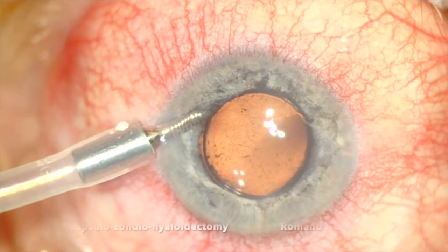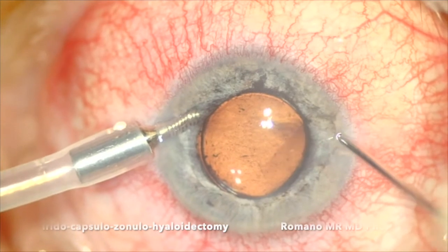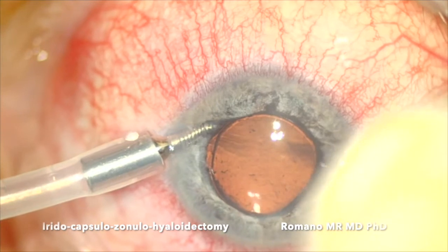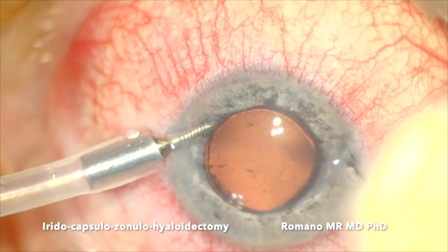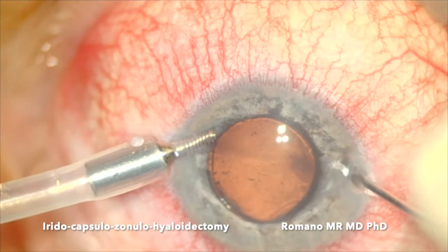In this case a 25-gauge probe cutter, going to the anterior chamber straight down to the peripheral iris — so peripheral iridectomy, capsulotomy, zonulectomy, hyaloidectomy, and anterior vitrectomy.